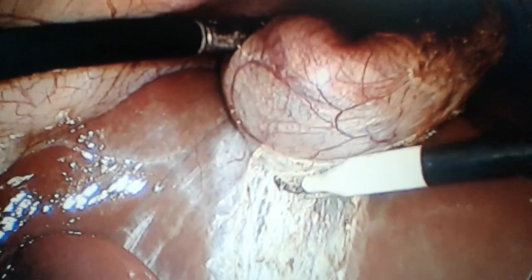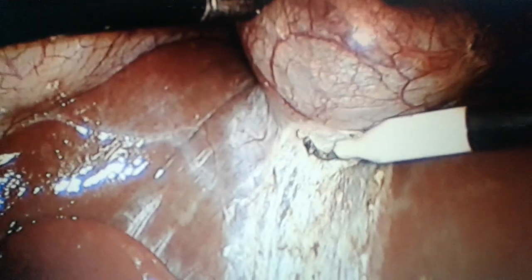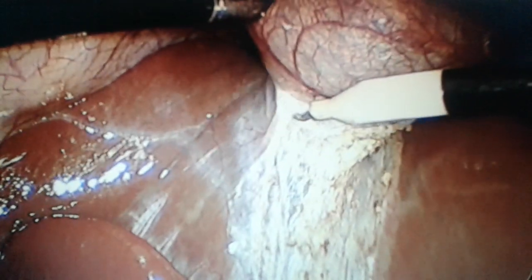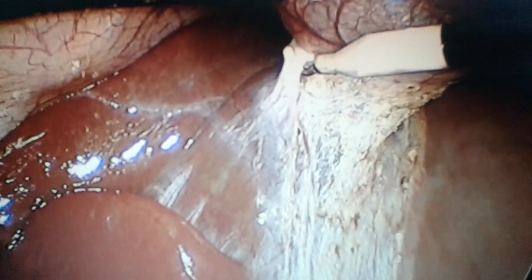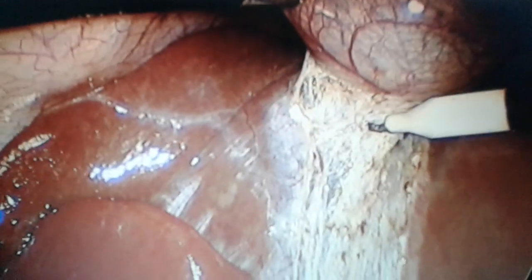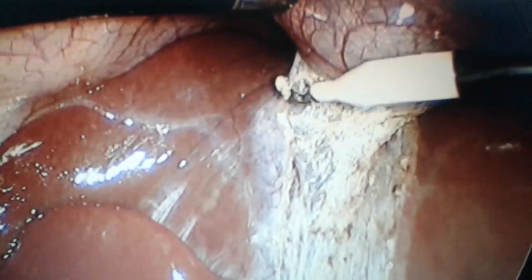Now, alternatively, by changing the traction, you just visualize your field and then you work upon it like this. Just stay away from the liver tissue while taking the gallbladder from the gallbladder fossa.